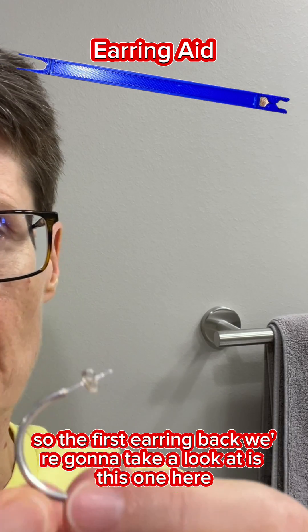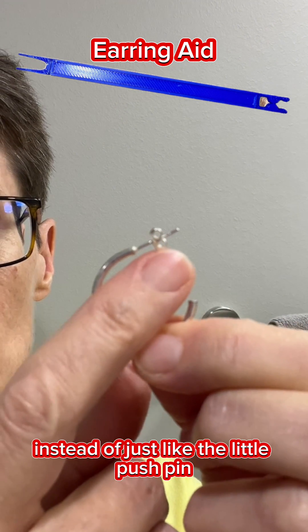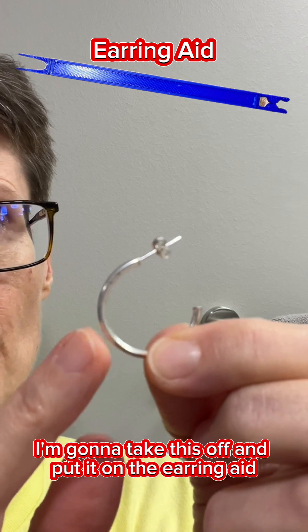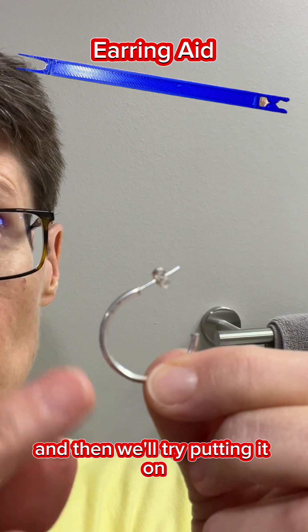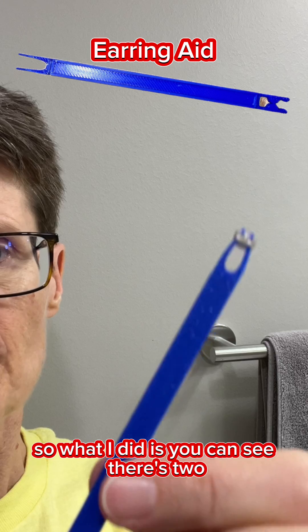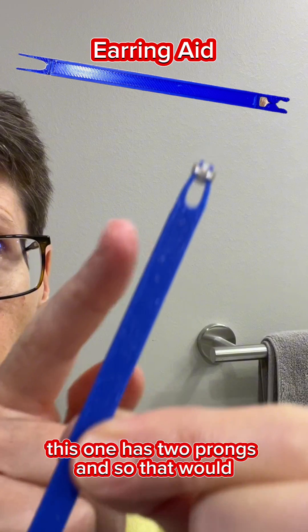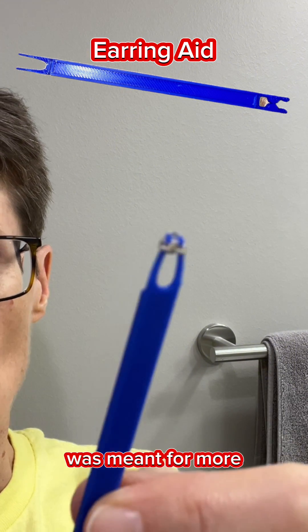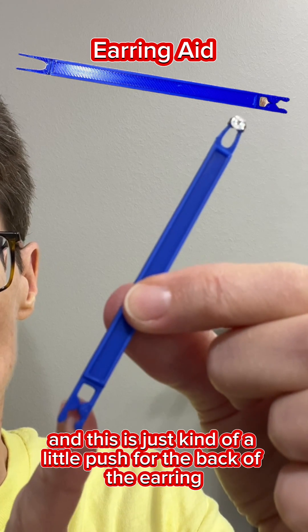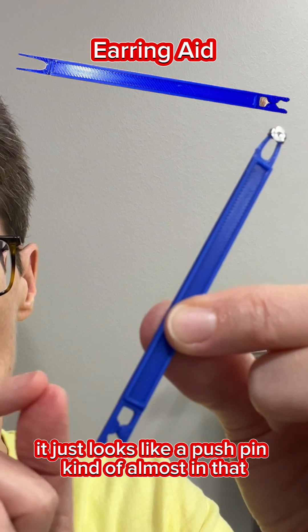The first earring back we're going to look at is this one — it's got two loops on it instead of just a little push pin that goes on the back. There are two different ends on the earring aid: one end has two prongs, which is meant for the earring back with the little loops, and the other end is more of a push for the kind of back that looks almost like a push pin.